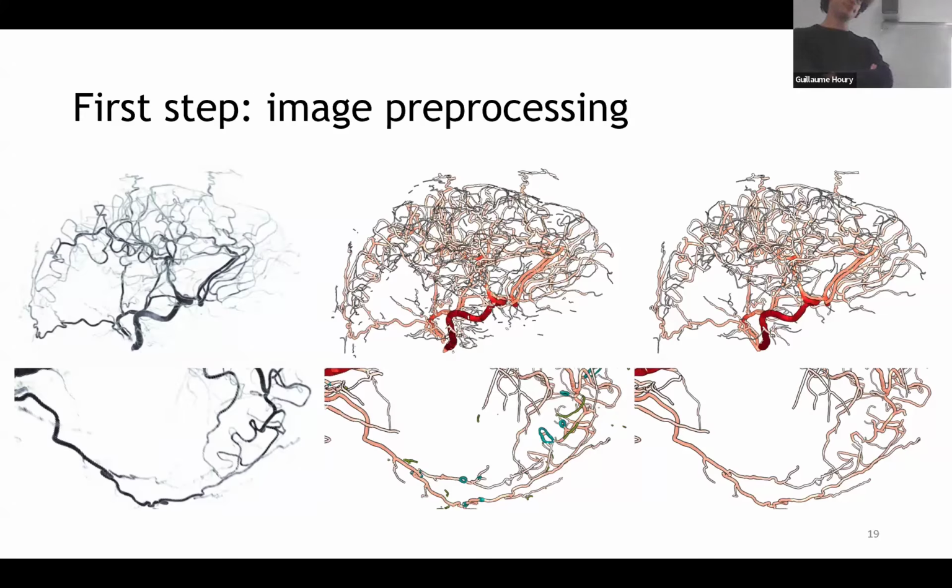You take a second image, so now you see the skull plus the blood vessels. Then you turn on the respiratory system again. And the idea is that because the patient is completely still, to get the segmentation of the blood vessels, you just need to subtract the first volume, where you only had the skull, from the second, contrast-injected volume. So it means that for free, no deep learning involved, you get this super high resolution image on the left.